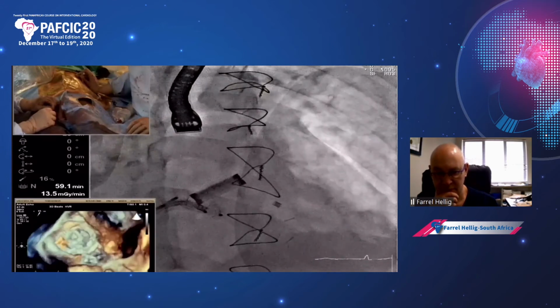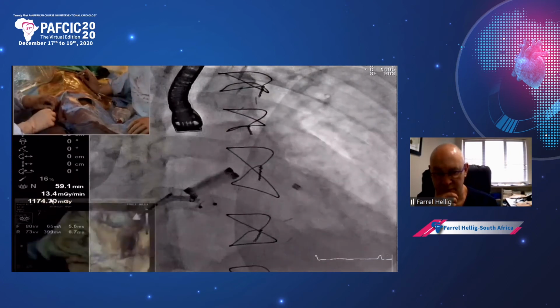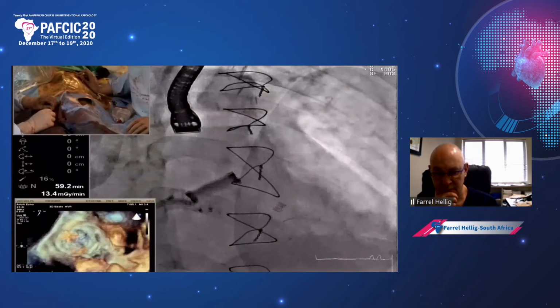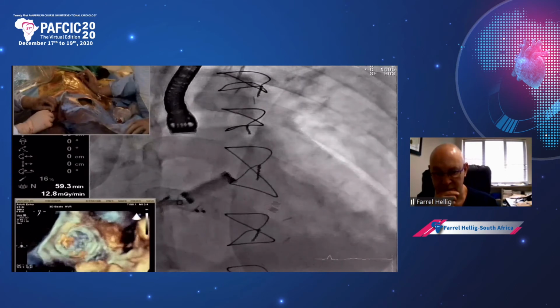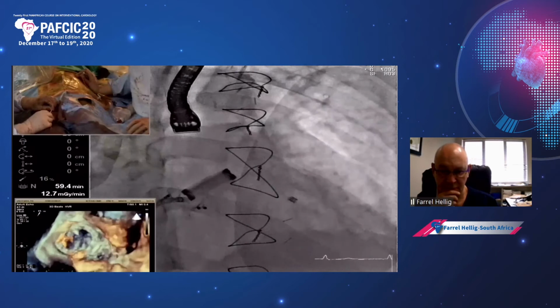How are the discs? Okay, discs are moving well. I feel a little close to the disc. Yeah, looks good. Have to pull it a little more. I'm leaning on it a little more. I think that's better. Yes.